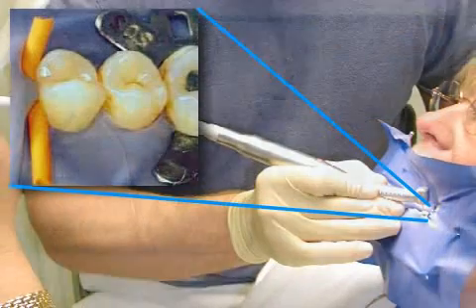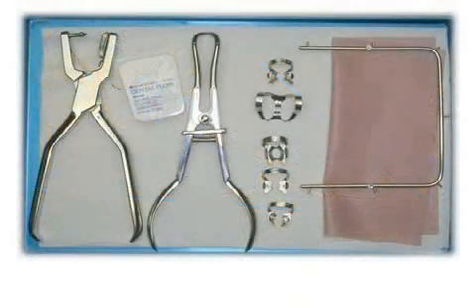There are many varied versions of dental dams. The latex membranes are also available in various colors — in this image, pink ones.